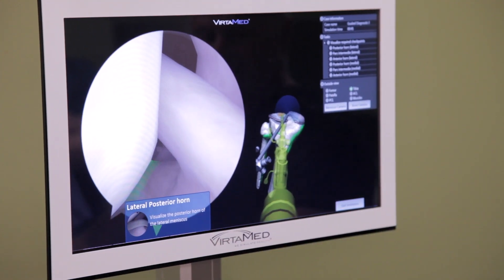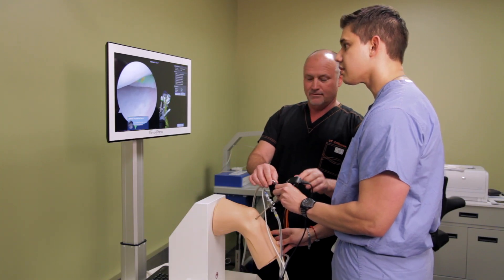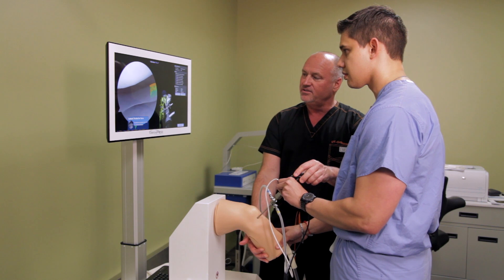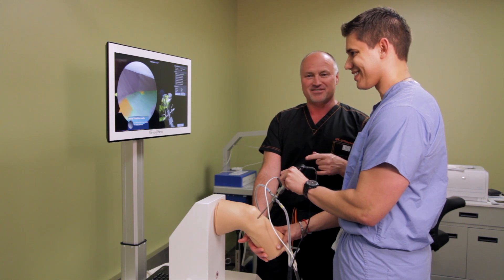Now it wants us to visualize the lateral meniscus, so it should be happy with you. That would show more if we pull it in — see how it opened up when I pulled it into varus? And so now it said, hey great, you saw it, so you passed step one.